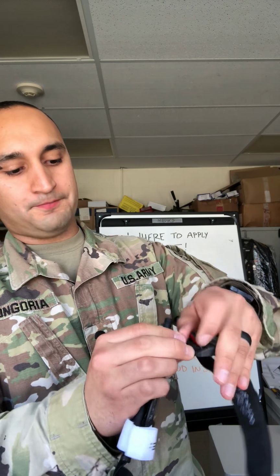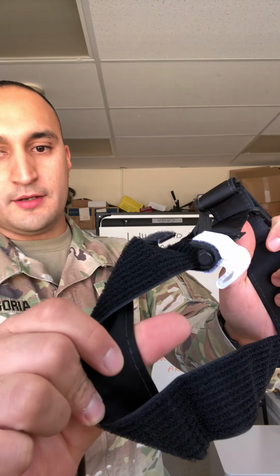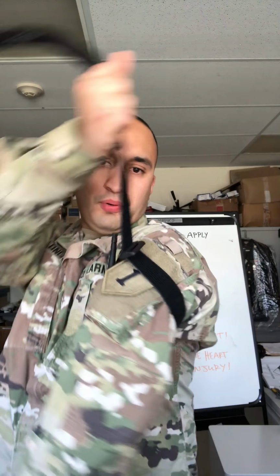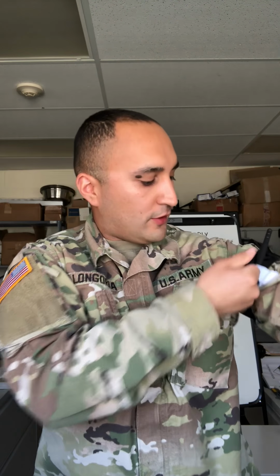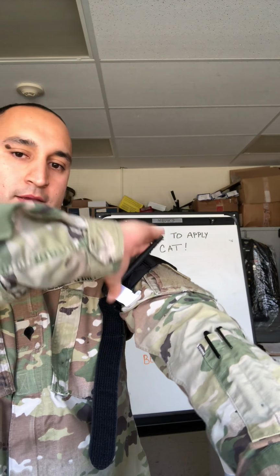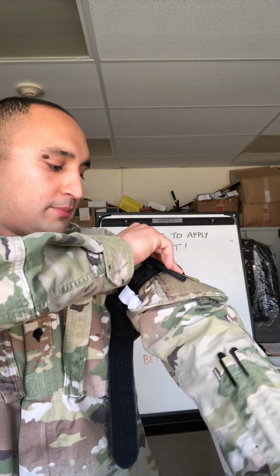So if you insert the red tab of the combat application tourniquet and you place the smooth portion above the extremity or wound, you then pull the tourniquet as tight as you can and wrap the Velcro all the way around. Then you can use your windlass rod to tighten the combat application tourniquet.